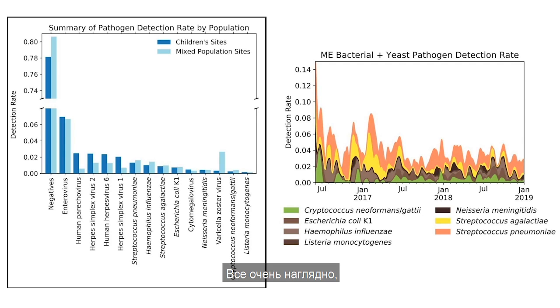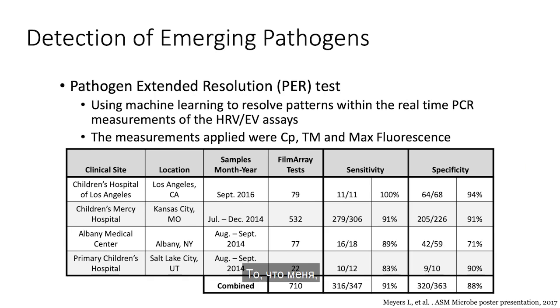It's a nice visual way, and it compiles the data for you, versus having it done manually, which is something we used to have to do pretty much on a weekly basis. What I actually get is a weekly report from the BioFire Trends group that summarizes the positivity rate and the prevalence of each pathogen that we've detected, which is nice.